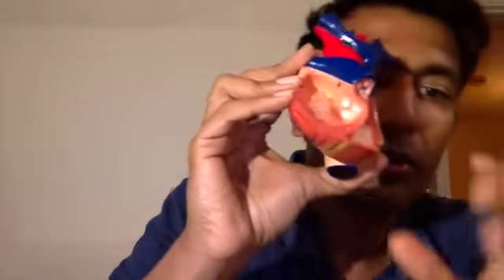And then finally, there is the aortic valve in the left heart. Okay, so the next structure to study is this valve here. This is the aortic valve. Note that it doesn't come very clearly in this picture, but if you look very clearly, yeah, there you go. You see it's got three cusps. And in cross-section, it looks a little bit like a Mercedes-Benz sign. So when you look at it on the scan, it looks like a Mercedes-Benz sign.